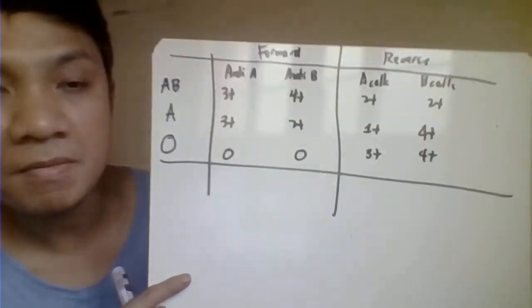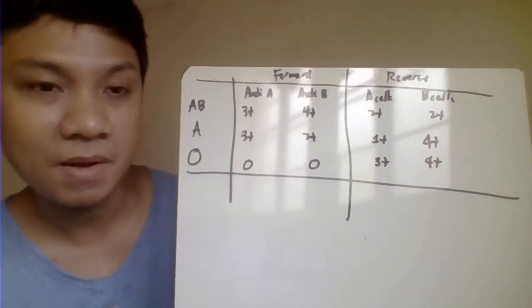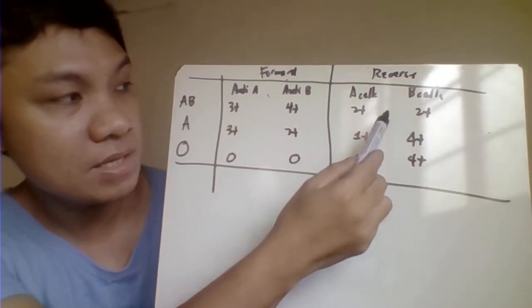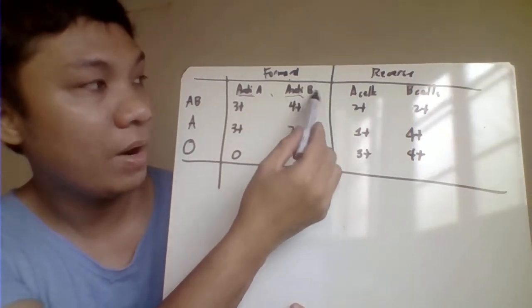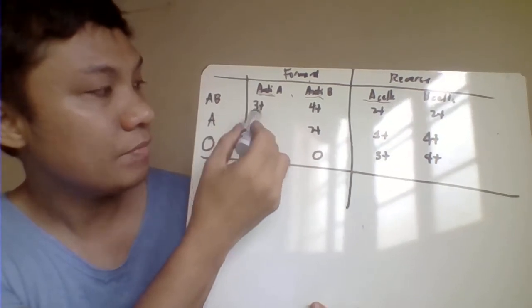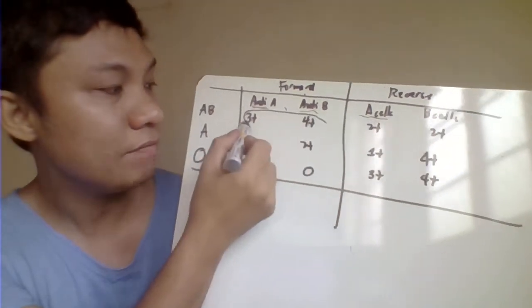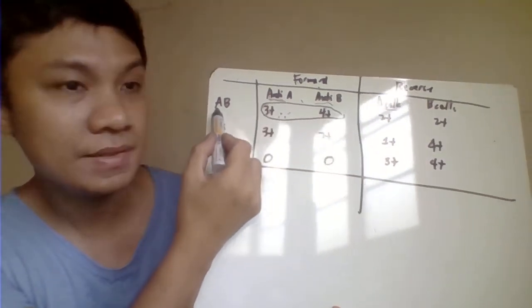Okay, then we have here, paano malaman kung anong blood type ni patients? Again, the true reaction, always 3 plus or 4 plus ang reaction natin dapat. So this is your forward typing, you're detecting for antigen. This one is reverse typing, you're detecting for antibody. Itong mga reagent natin, anti-A, anti-B for the forward, reverse is A cells and B cells here. Notice here for this one, so pipiliin mo lang 3 plus saka 4 plus. Never mind the other na reaction. So notice here, ito yung positive natin, 3 plus 4 plus. So this will signify the patient's type AB.